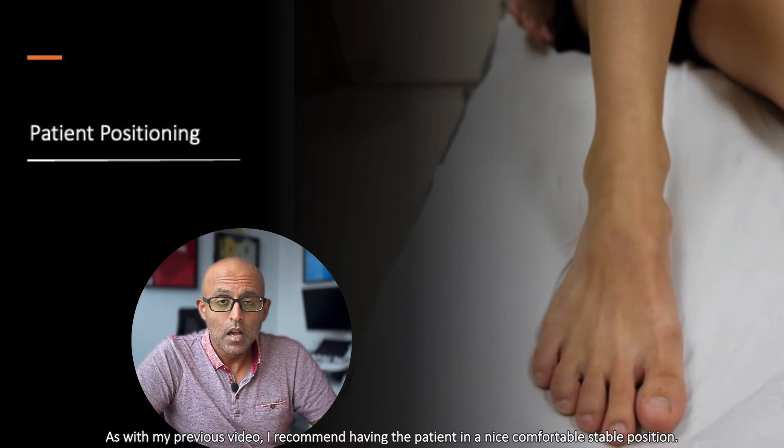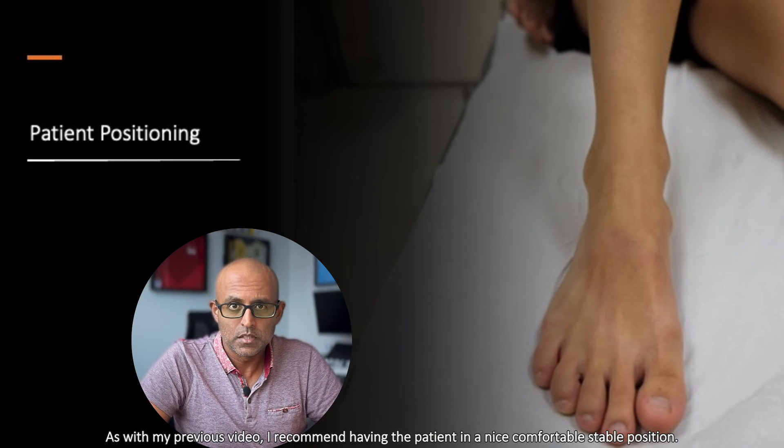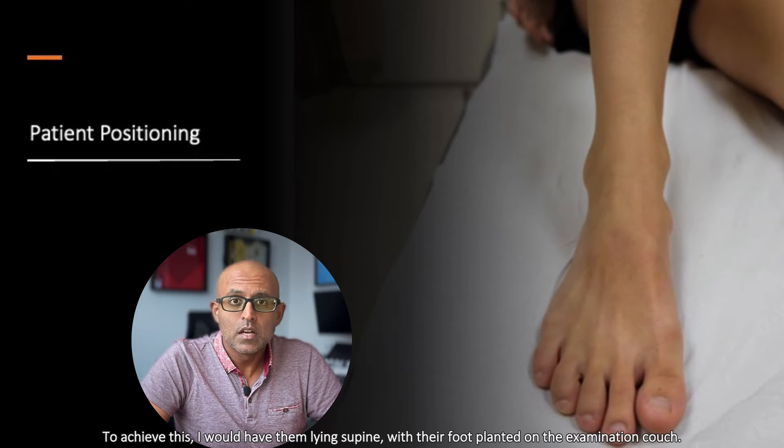As with my previous video, I recommend having the patient in a nice, comfortable, stable position. To achieve this, I would have them lying supine with their foot planted on the examination couch.